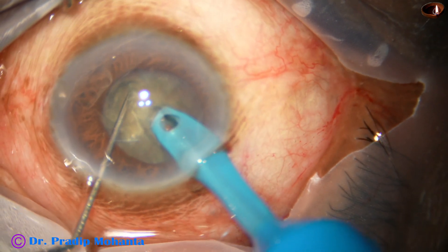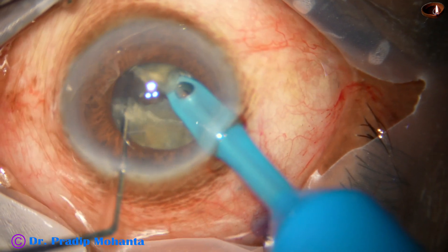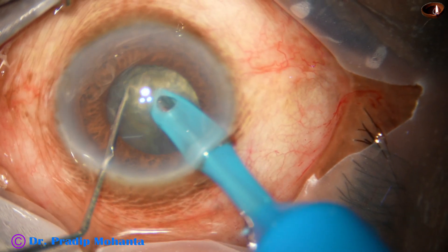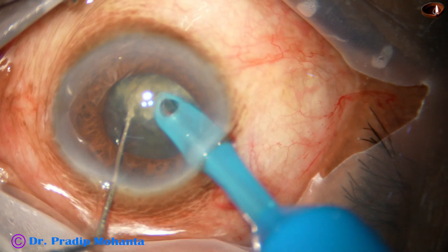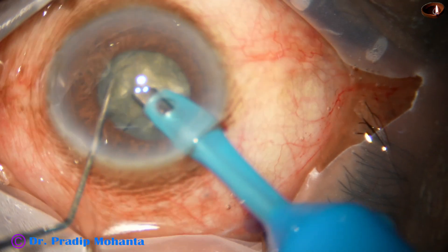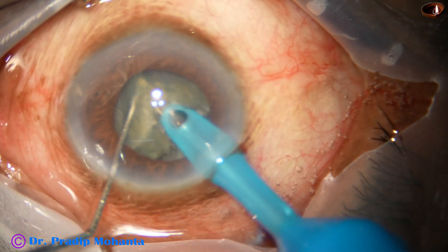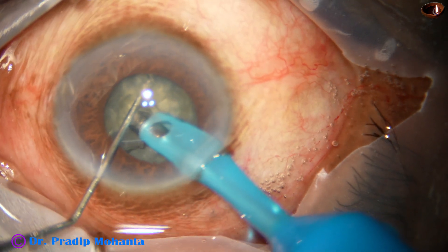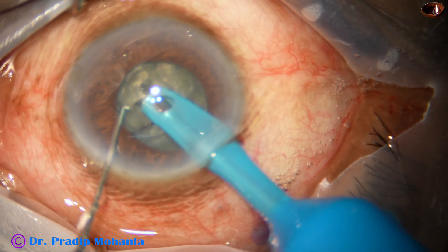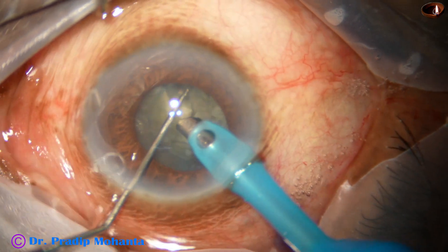Now my plan is to do direct chop, direct vertical chop, and to divide the nucleus into several pieces. This is the first crack and this is the second crack, and I'm trying to make many more cracks. I'm using 475 millimetre of mercury vacuum, 47 ml per minute flow rate. Ultrasonic energy used is 70%.